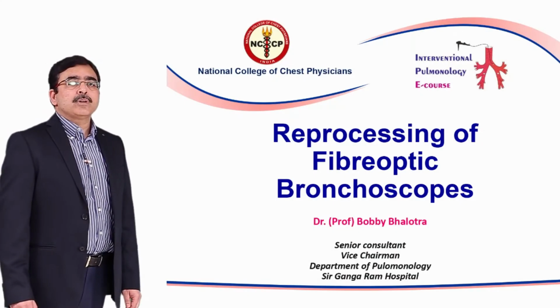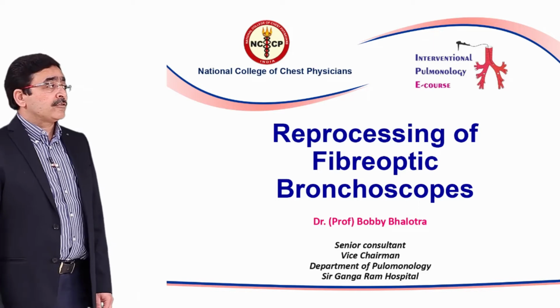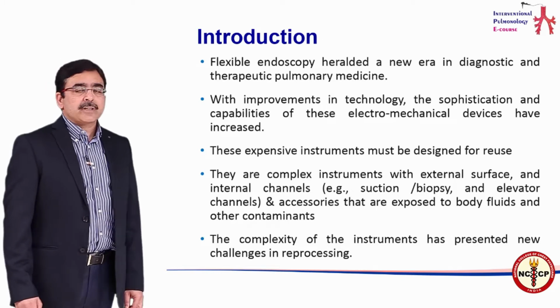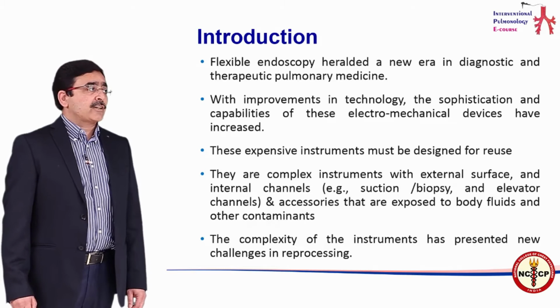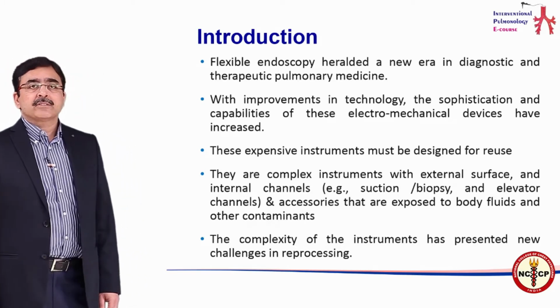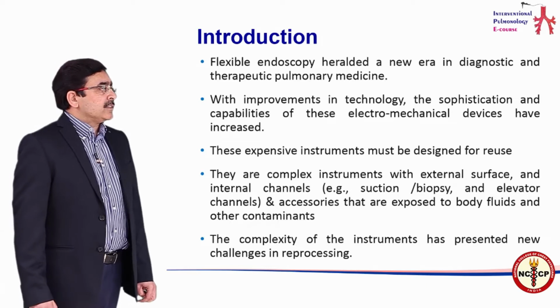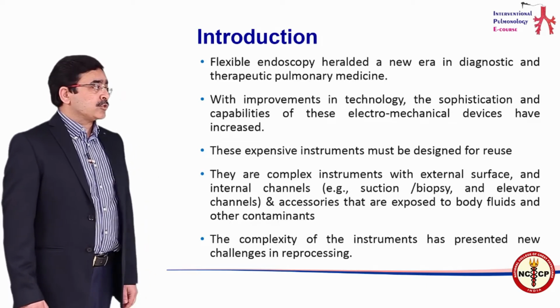In this teaching module, I am going to be talking about reprocessing of fiber-optic bronchoscopes. Flexible endoscopy heralded a new era in diagnostic and therapeutic pulmonary medicine. With the improvements in technology, the sophistication and the capabilities of these electromechanical devices have increased tremendously. These expensive instruments are not disposable, so they have to be reused.